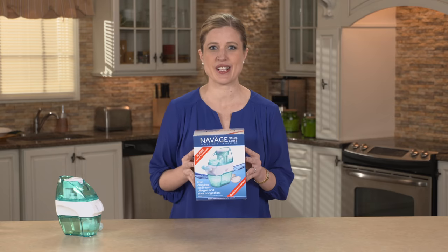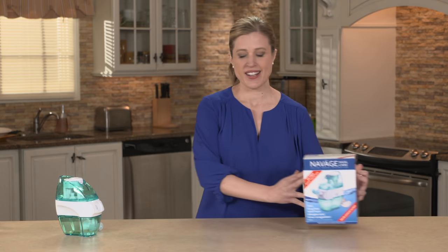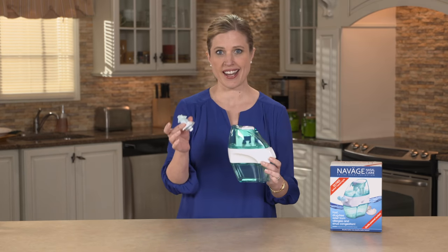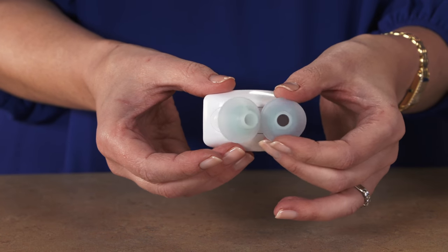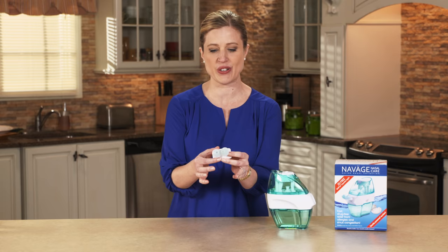You've just gotten your Naväge Nose Cleaner and you want to get started? I'm going to show you how today. What you would have received in your box is this base unit as well as your nasal dock. The nasal dock has two nasal pillows on them. They're made out of a medical grade silicone and these are really nice and soft and flexible, so that's going to help you put them comfortably in your nose.